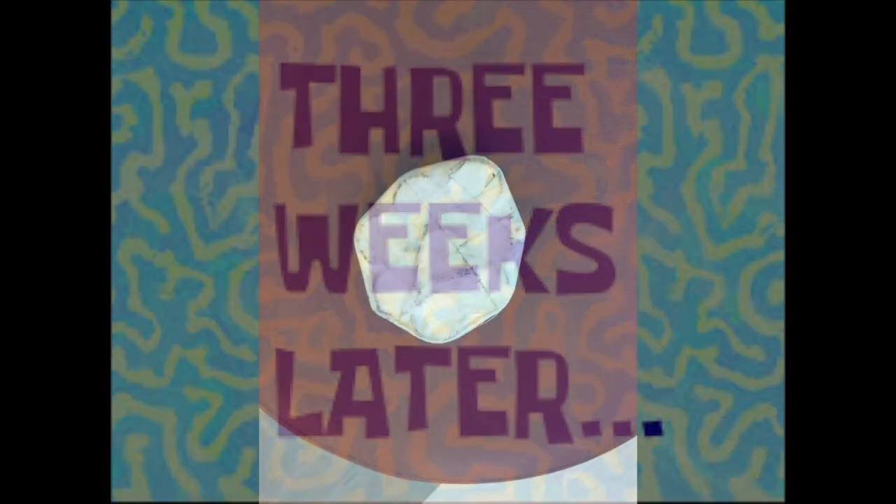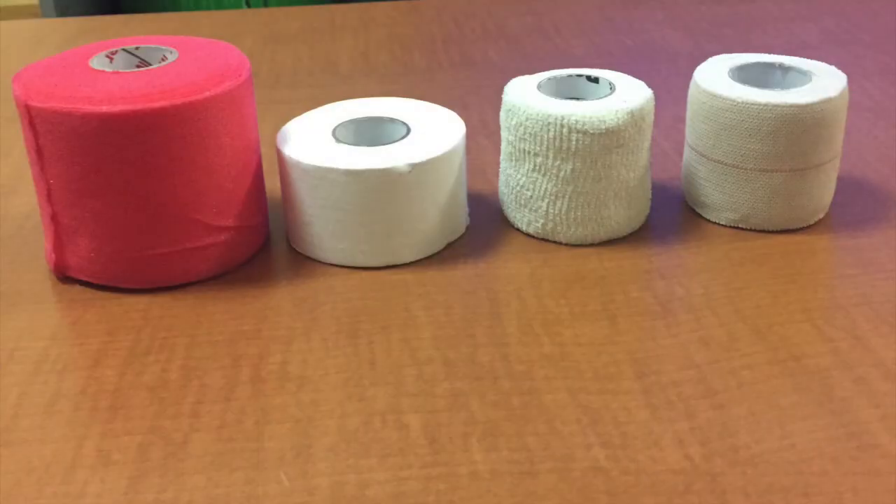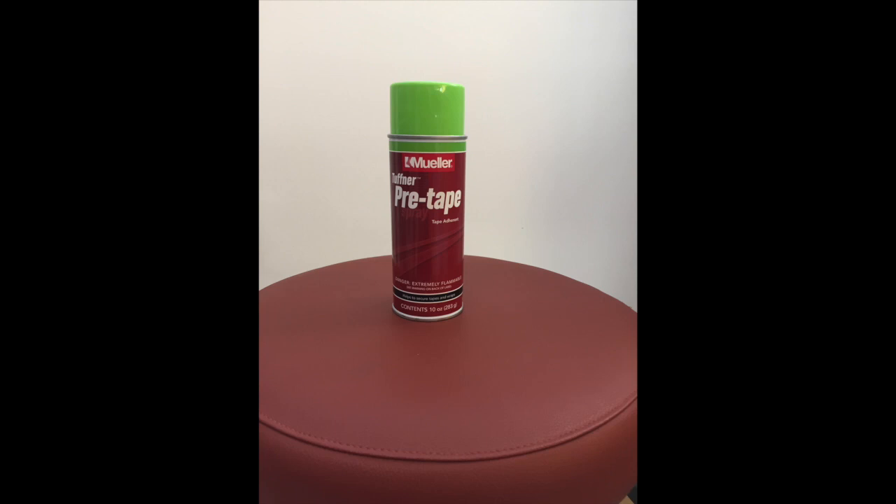Three weeks later. A bolster is necessary to put under the athlete's heel to put them in a pain-free knee range of motion. From left to right, we have pre-wrap, one and a half inch non-elastic white athletic tape, two inch cohesive stretchy tape (i.e. Coban), and two inch elastic on. Limit storage of non-elastic and elastic tapes to a one year period. Store in the original box or in an area protected from excessive pressure and heat. This is tough skin, used to make tape stick to skin better. Usually we would spray tough skin from mid-thigh to mid-calf, but in this case our athlete is allergic, so we will be applying pre-wrap from mid-thigh to mid-calf, overlapping by half.